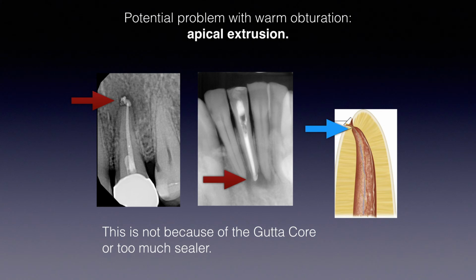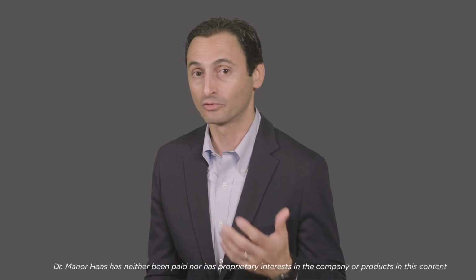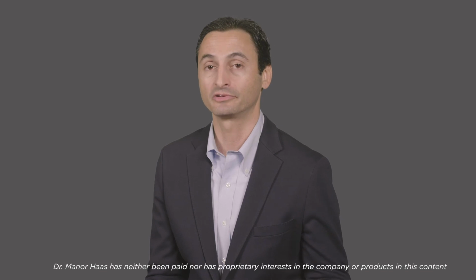So it brings me to one of the other misconceptions, and that is a question I get sometimes, where people say, well, sometimes I get this obturation where the GuttaCore goes out the apex. Shouldn't happen often. If it does, why does it happen? Am I using too much sealer or not? Well, apical extrusion is something that I've rarely seen due to the GuttaCore. It actually has to do more with the instrumentation or the obturation.